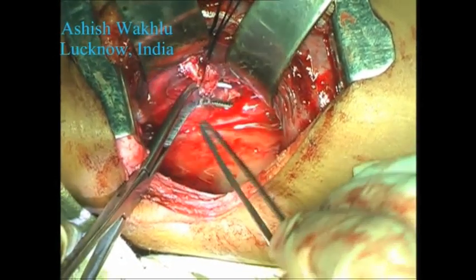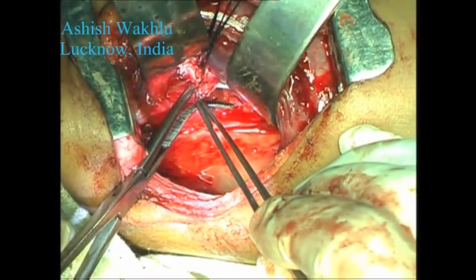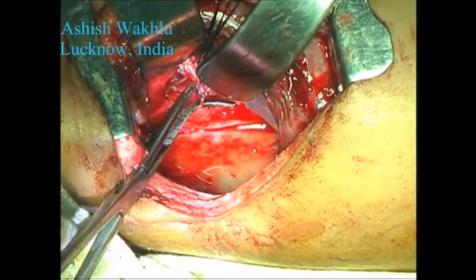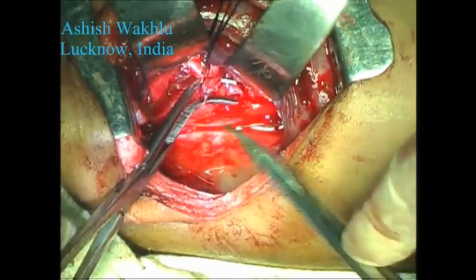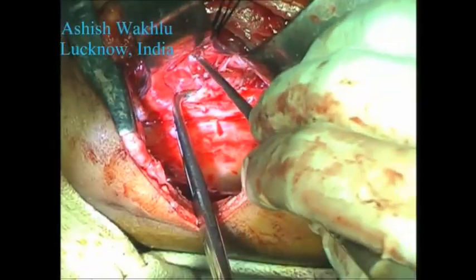And therefore, we have to keep persistently dissecting away at this fibrotic tissue until the stump of the right main bronchus is brought into view and mobilized sufficiently for anastomosis to the lung hilum.